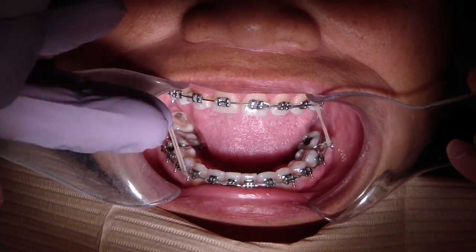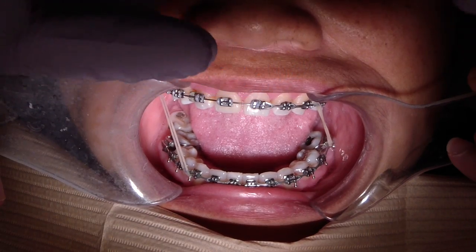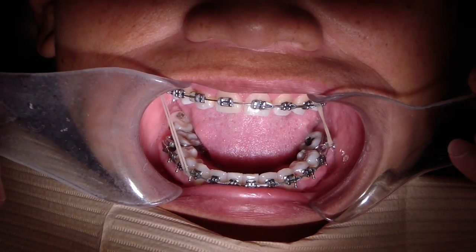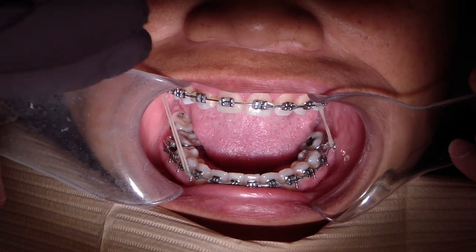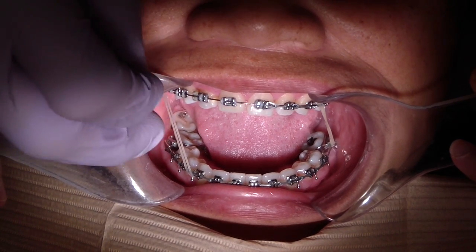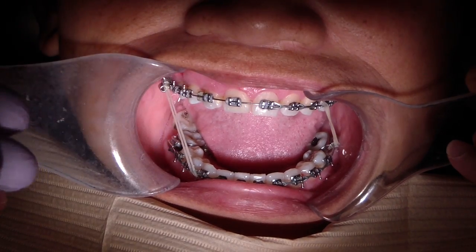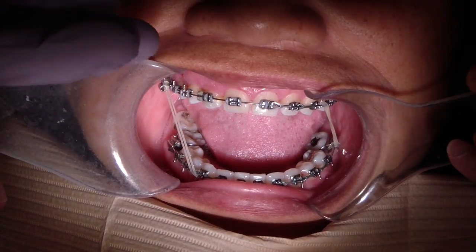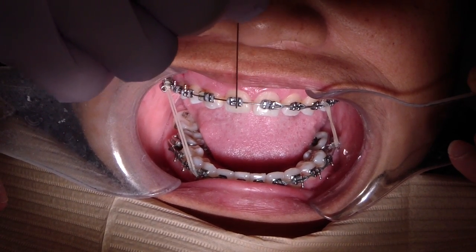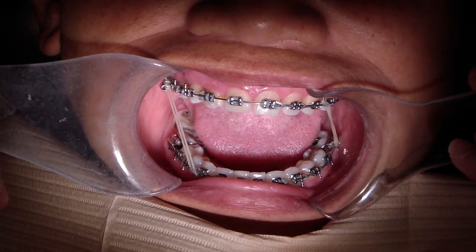On the maxilla, we're trying to move the arch to the left, and on the mandibular arch we're trying to move it to the right — speaking in terms of midline movement rather than the whole arch shifting. We've placed class 3 elastics on the right side to generate forces to help move the midline. As you can see, it's almost on — just an aid to continue moving the maxillary midline to the left.